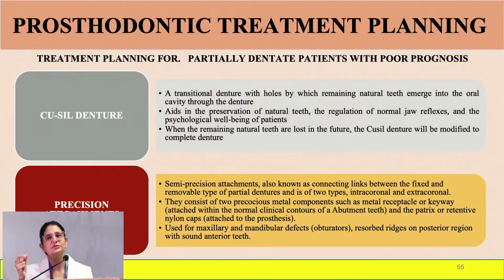So we can give the immediate denture, and different types of overdentures can be given, utilizing various copings or metal copings or the bar or design depending upon the inter-ridge distance present.